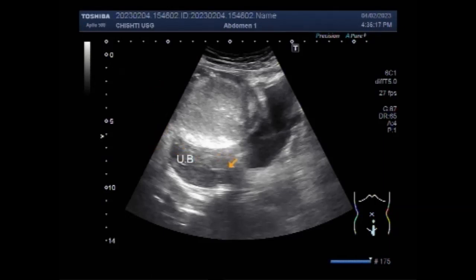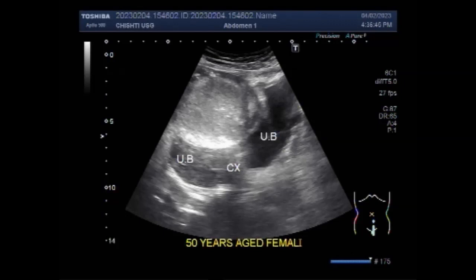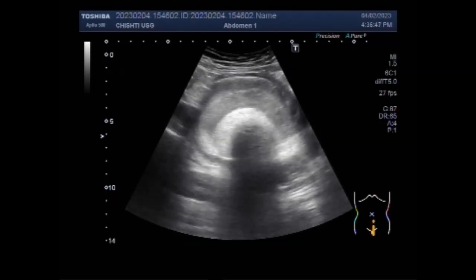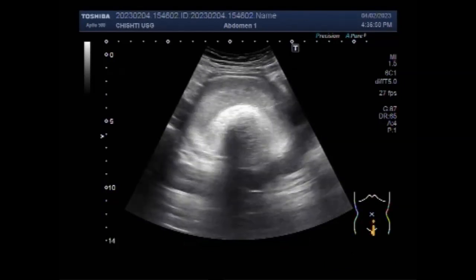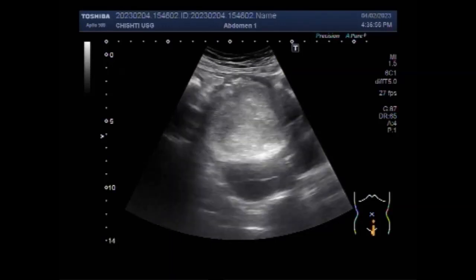This is the uterus, mistakenly labelled as urinary bladder. This is a large ovarian cyst and you will see a semi-solid to solid mass in its interior. The patient is aged about 50 years and is female. A large semi-solid to solid mass is also seen in the interior of the chocolate cyst.